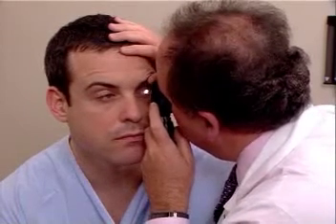Looking superior nasal, inferior temporal, superior temporal. And Mr. Johnson, look at the light, please.